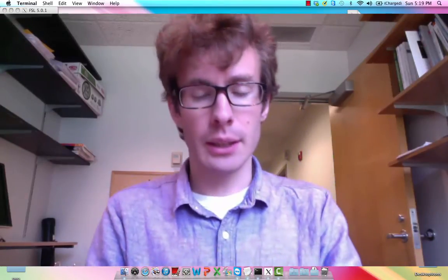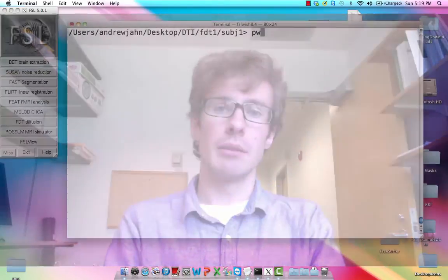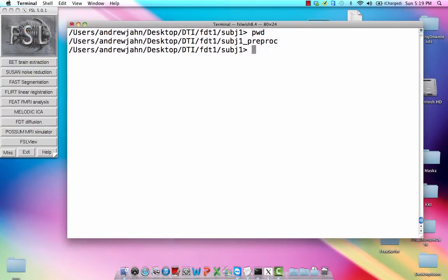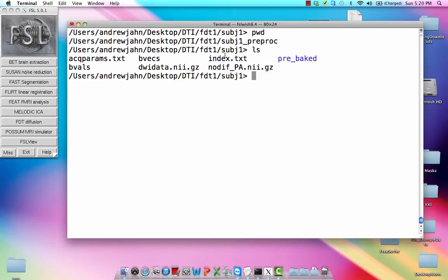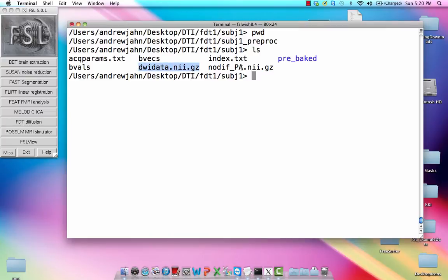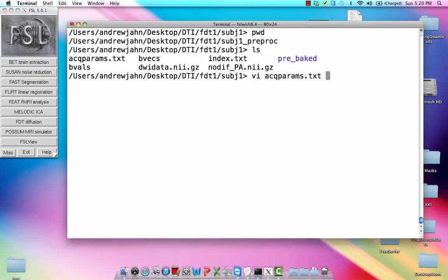So let's take a look at the data that we have. Right now, I'm using the FSL tutorial data. I've downloaded it. It's in this file path. We're in fdt1 slash subject1 underscore preproc. So what we have in here, we have bvals, bvecs. That's just the stuff you'll need to do your DTI analysis. We also have the diffusion-weighted data set and this thing called ACK params.